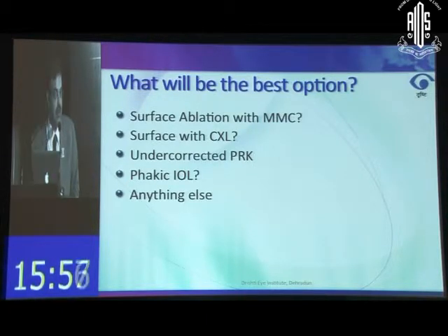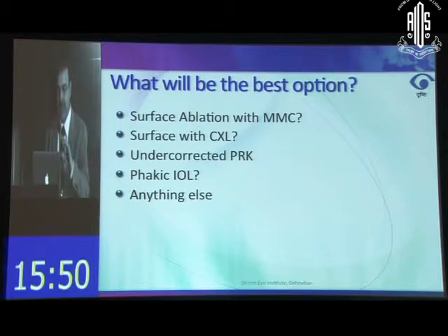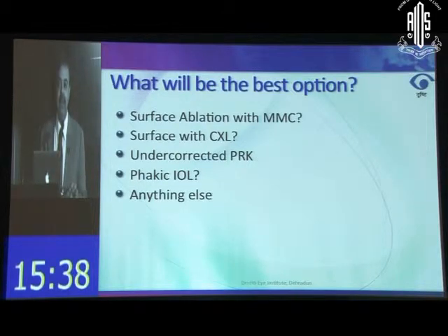So better to place it. So, I think the dictum today, and in fact there's been a lot of debate going on just over the last 2-3 days in the ASCRS forum on this, that now the cutoff for doing a surface ablation in many hands, people who are experienced with laser corrections, is now down to 450 if you have an absolutely healthy cornea, which means that no flags, no red signs.